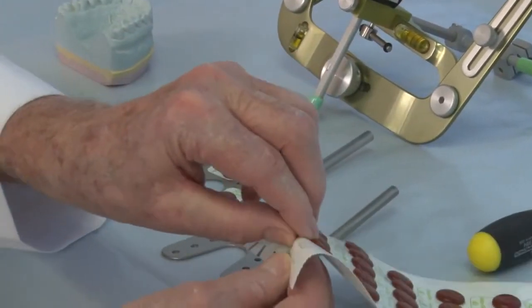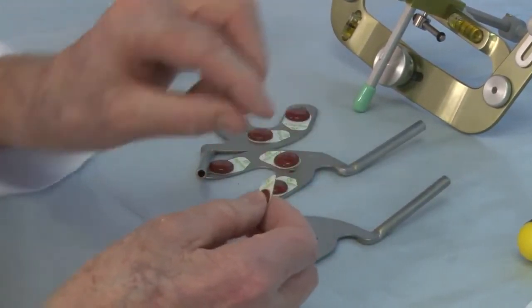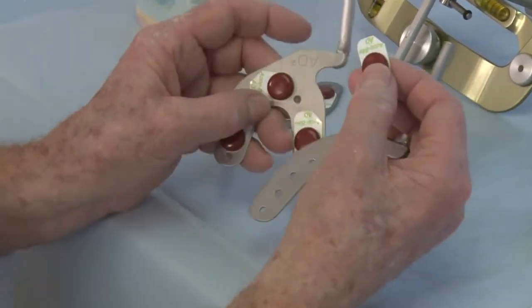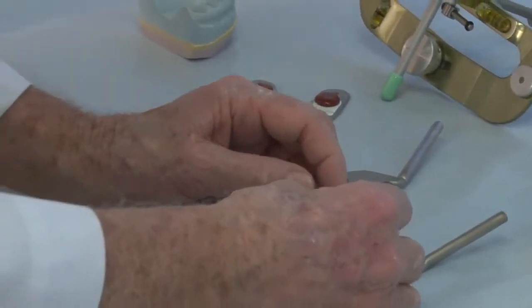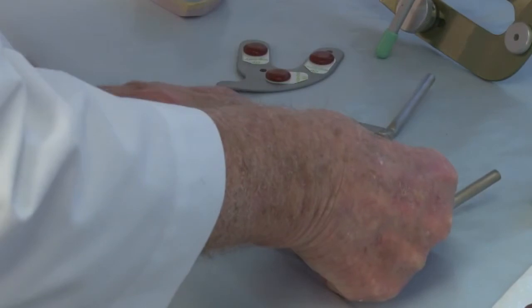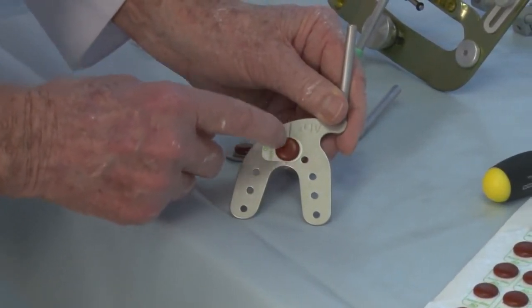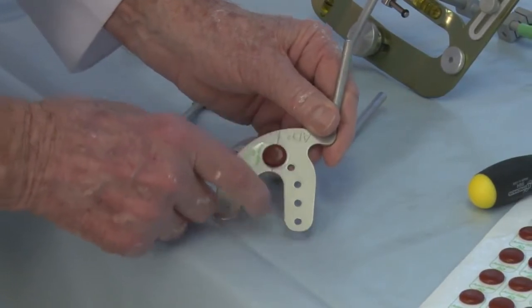So we peel off one of the AccuBites. Turn the corner a little bit. And we'll place the anterior section first. Looking at this one, we want to place it right on the midline. Like so. Notice the midline here. This midline on the bite fork has to line up with the patient's skeletal midline. And so we place the AccuBite right in the center of that midline.